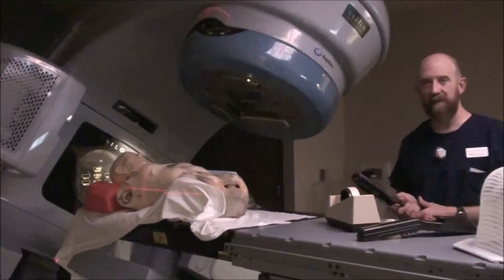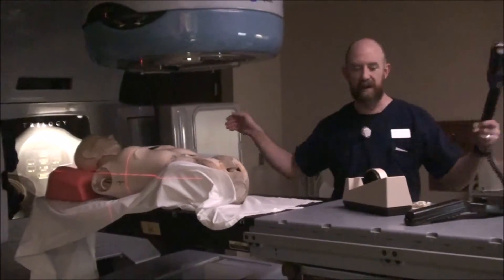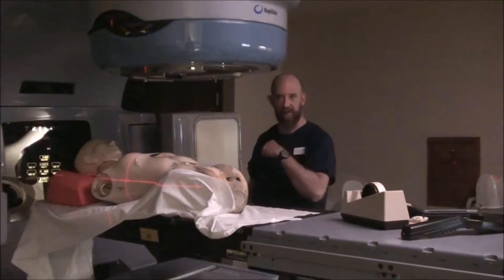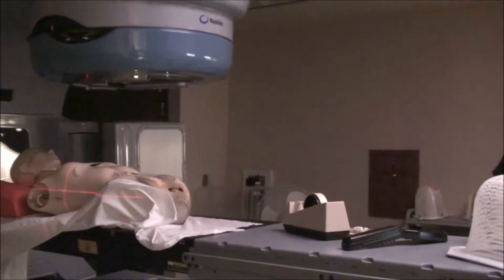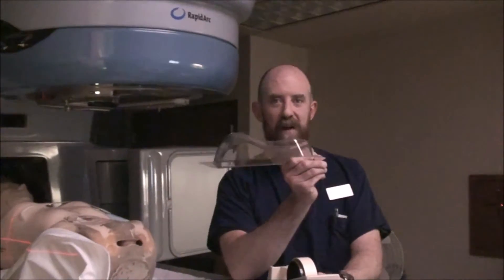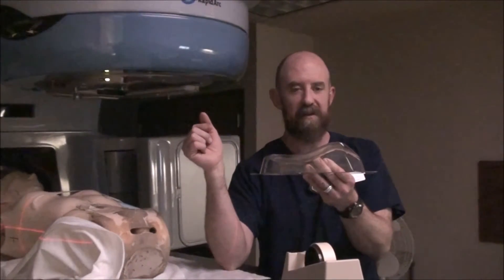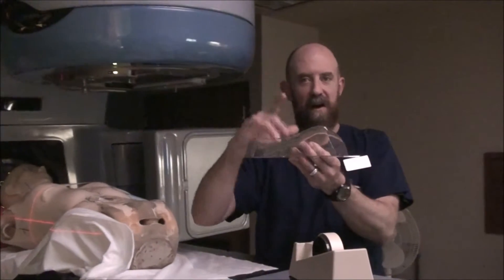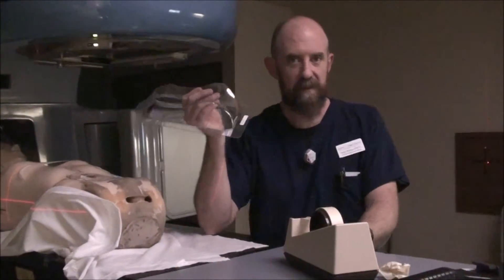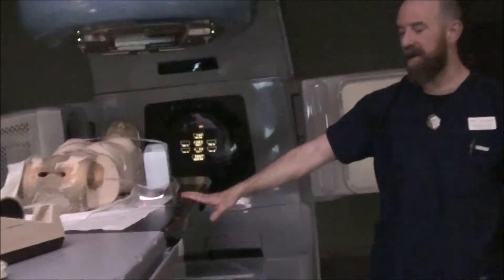Once you've done that, you're going to do all the normal things: take a photograph of the lateral, a photograph from the anterior, and a photograph of the whole thing. One additional thing you may do in this case is take a photograph just of the headrest position under the elbow — so that if you forget to document exactly what headrest you were using, you've got a picture of it. There are two different ways you can put this headrest, and you can see that changes the elevation of your elbow. You want to have it the same way every time. If you have a photograph of where the elbow fits on the particular headrest, you're going to be able to reproduce it much better.